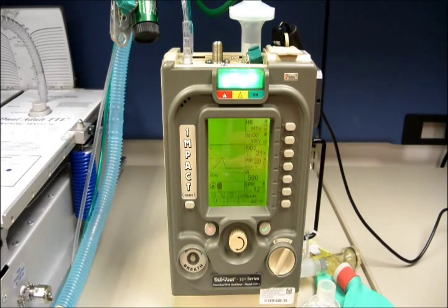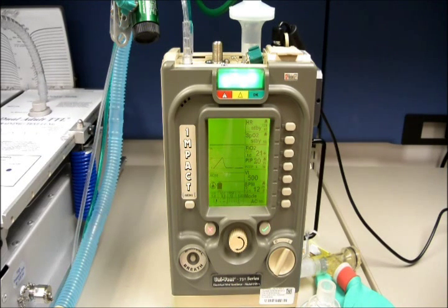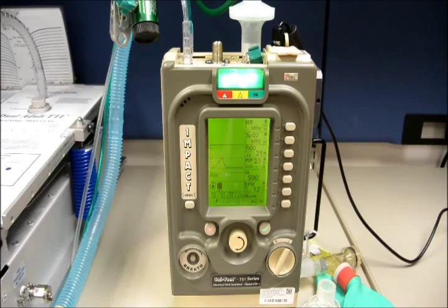Right now, I have my patient already set up on the ventilator, and now we need to set them up on low flow.